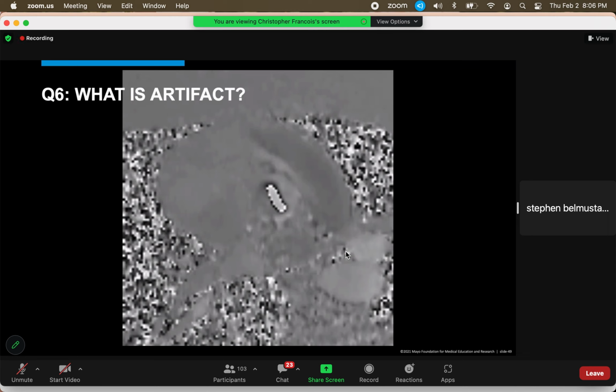You'd want to increase, I guess, the velocity, like some sort of threshold that it senses. I think if I saw it on a question, I'd probably recognize it. Yeah, exactly. We call that the velocity encoding, or VENC. So the multiple choice question might be, which parameter should you adjust? Is it the VENC, or velocity encoding? And that would be the correct answer.